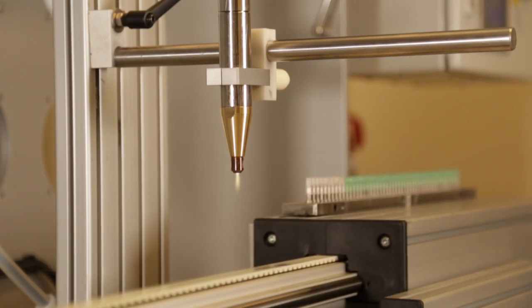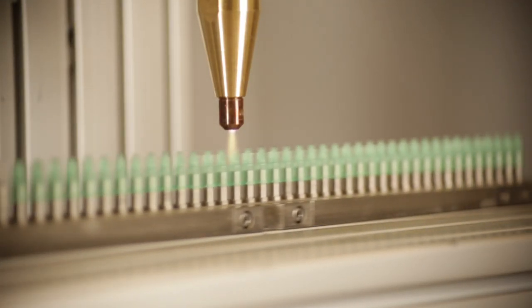The Tantec Needle-Tec system is a corona-based or plasma-based technology that allows the treatment of the inner hub prior to cannula adhesion.